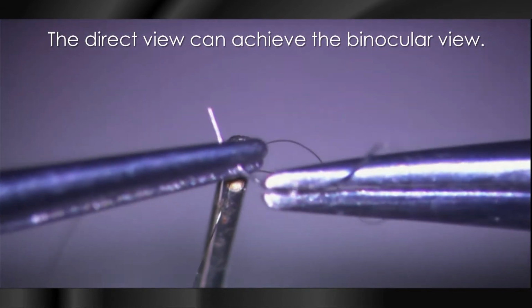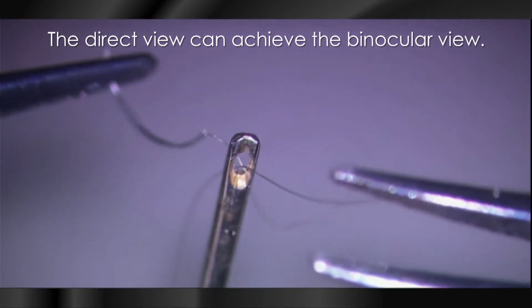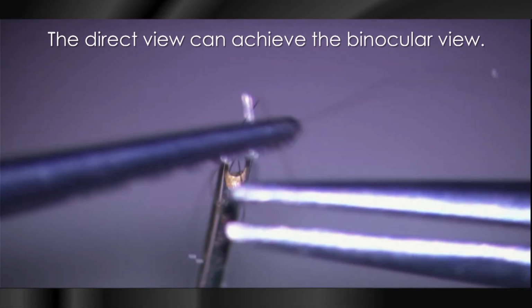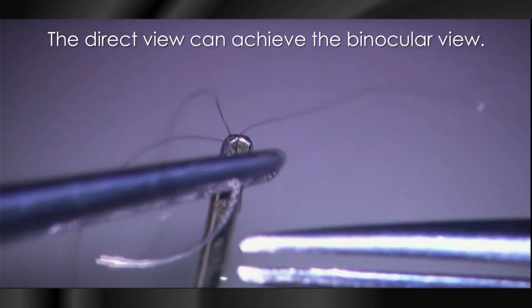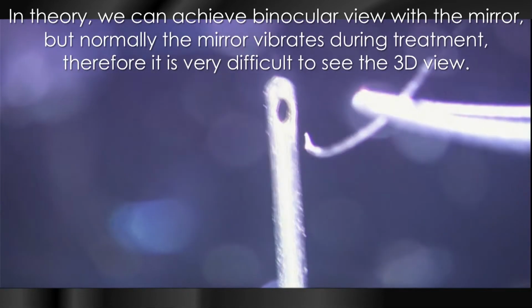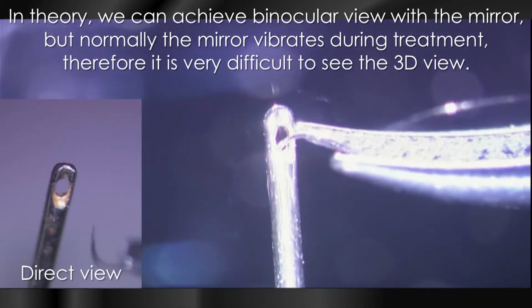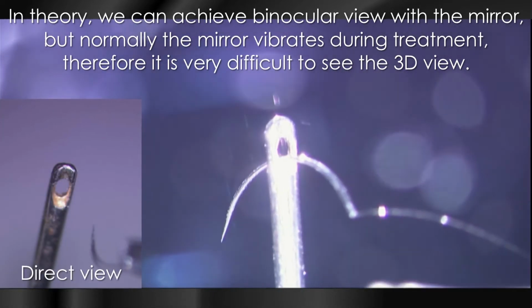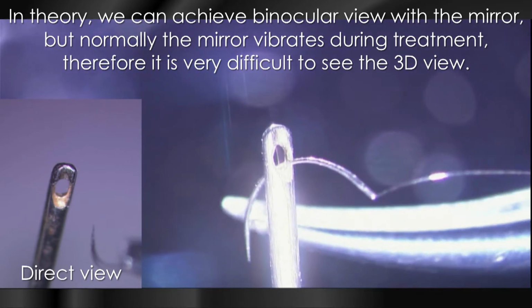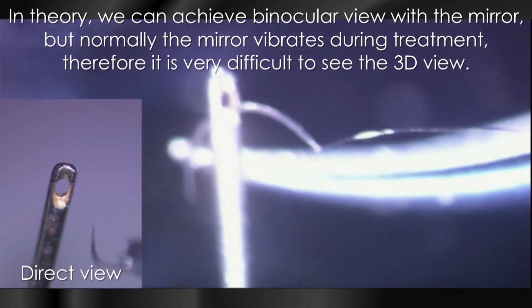Of course, with the direct view, we can use both hands during treatment. Easy to pass the thread. In theory, we can achieve a binocular view with the mirror, but normally the mirror vibrates during the treatment, therefore it is very difficult to see the 3D view.